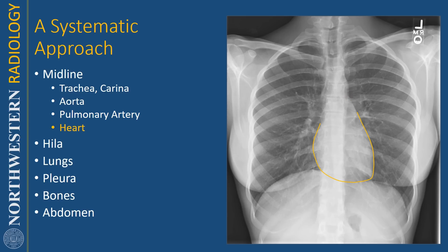Then I look at the heart: the left atrium, the left ventricle. The inferior border is usually not something you can see on a frontal chest x-ray because of the similar density between the heart and the diaphragm. So inferiorly, the heart touches the diaphragm and you don't actually see this border. Then I look at the right atrium and, of course, the SVC.